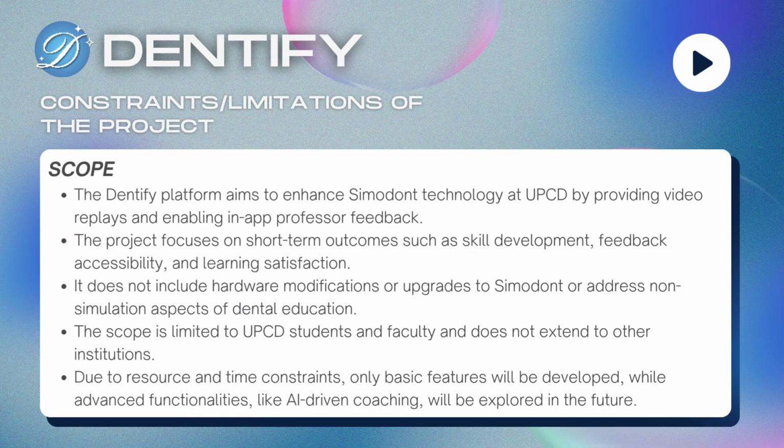Moving on to the constraints and limitations of the project, Dentify is designed to enhance Simodont technology at UPCD by enabling students to review their sessions through video replays and receive in-app feedback from professors. The project focuses on short-term outcomes such as skill development, feedback accessibility, and learning satisfaction. It will not involve hardware modifications, address non-simulation aspects of dental education, or extend beyond UPCD.